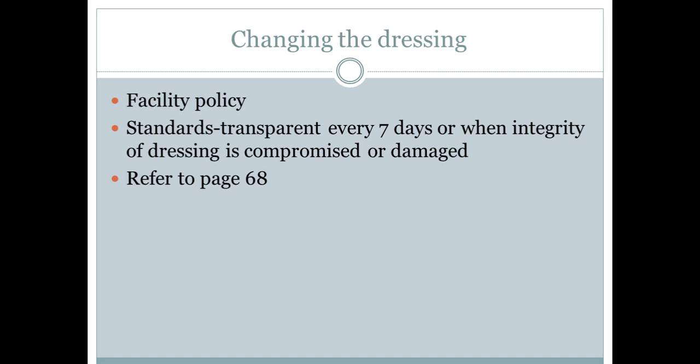Definitely assess that venipuncture site for any signs of infection, including redness and tenderness, any infiltration, coolness or blanching or edema, thrombophlebitis, firmness or any bumps or pain along the path of the vein. If you do see those, definitely apply pressure to the area with the sterile gauze and remove that catheter tip, and then go through your procedures for discontinuing and assessing that catheter and catheter tip. Apply pressure to that site until the bleeding stops, and then apply an adhesive bandage.